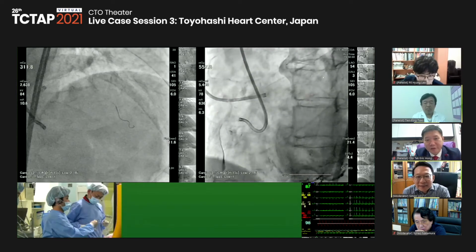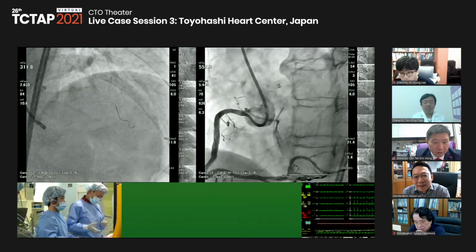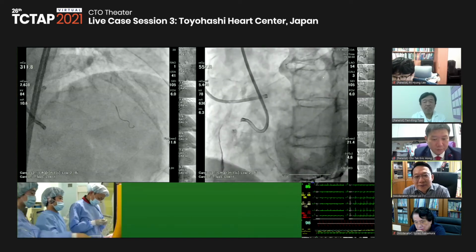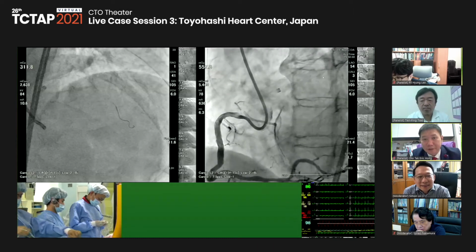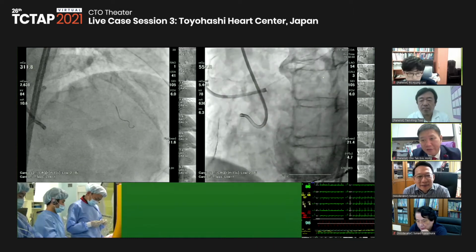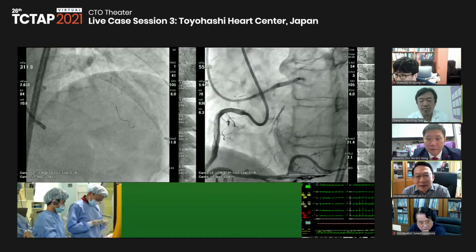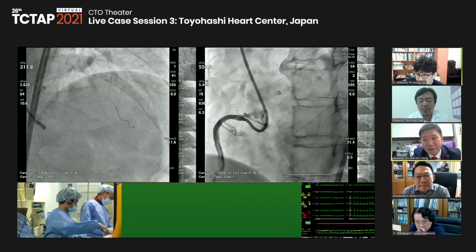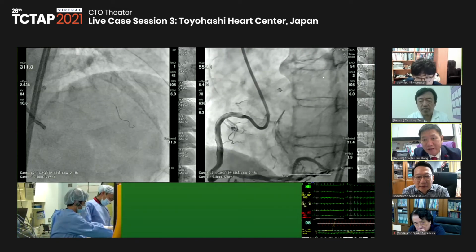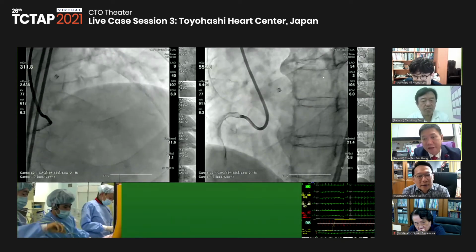Your comment. Can't hear you. Can you hear me now? Yes, we can hear you now. Yeah, I agree. In this case, I would actually attempt antegrade first, and then if I can't, then I will go to retrograde. But my first choice would still be antegrade.